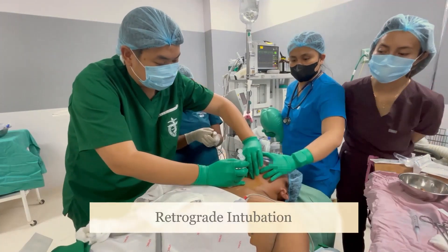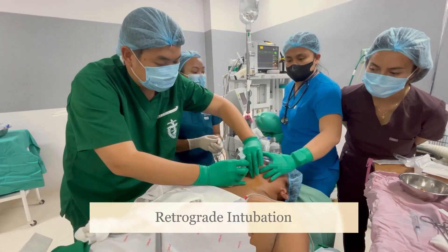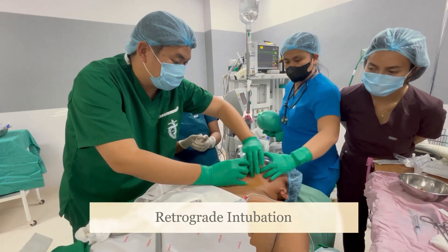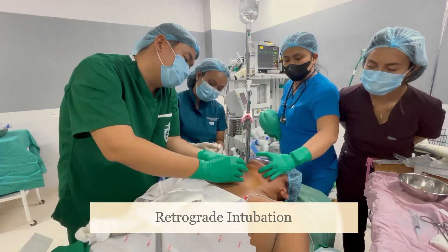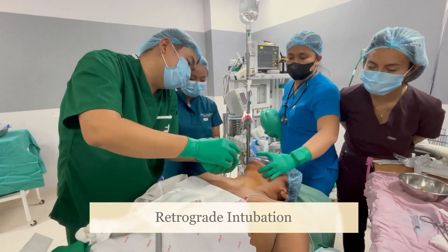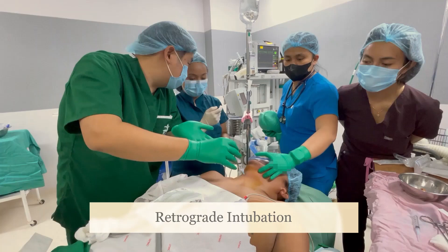These are the steps in performing retrograde intubation. Hyper-extend the neck of the patient by placing a shoulder roll. If you are performing retrograde intubation in an awake patient, you could perform a transtracheal block.